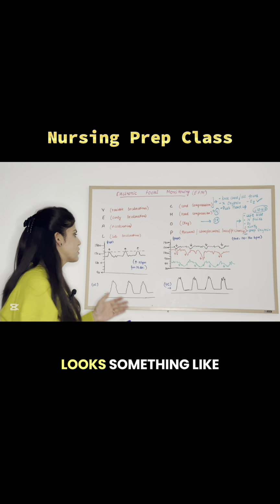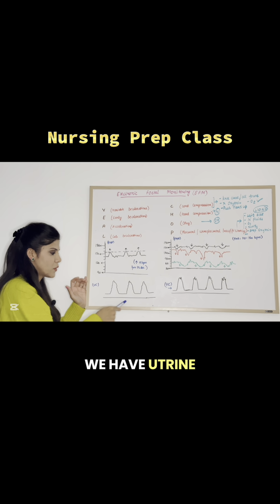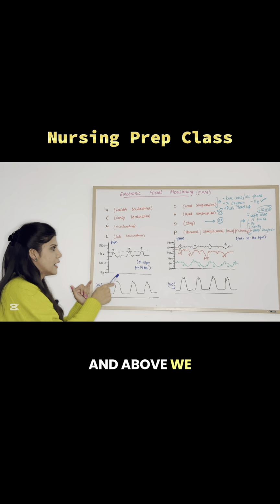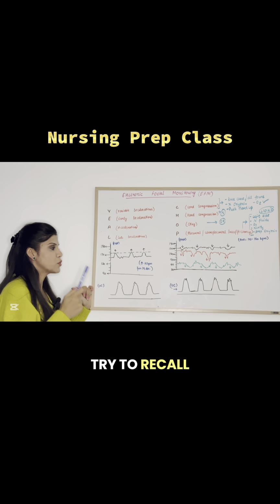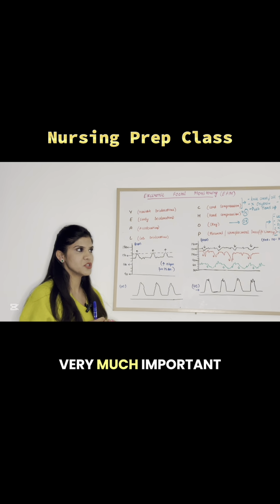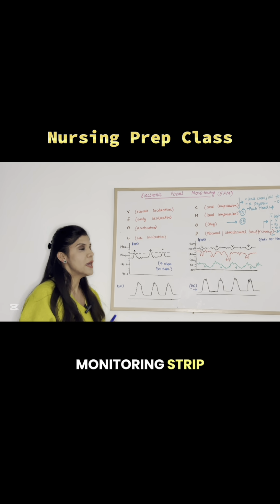So the fetal strip looks something like this. On the lower section of the graph, we have uterine contractions depicted like this, and above we have the fetal heart rate depicted in this way on the graph. We then try to correlate the fetal heart rate to the uterine contractions. For NCLEX, it is very important that we know about the electronic fetal monitoring strip and the changes which we can see on that strip.